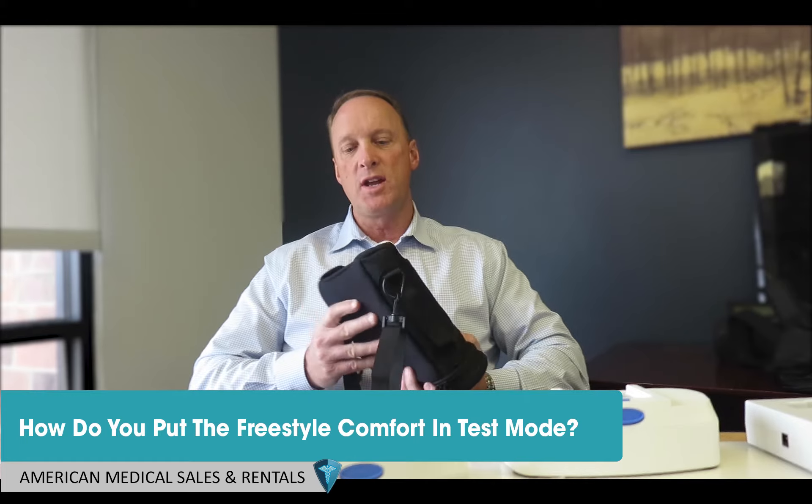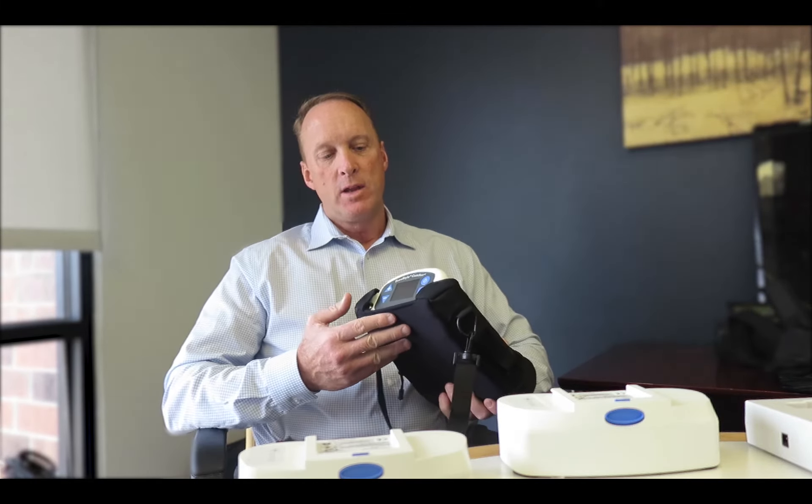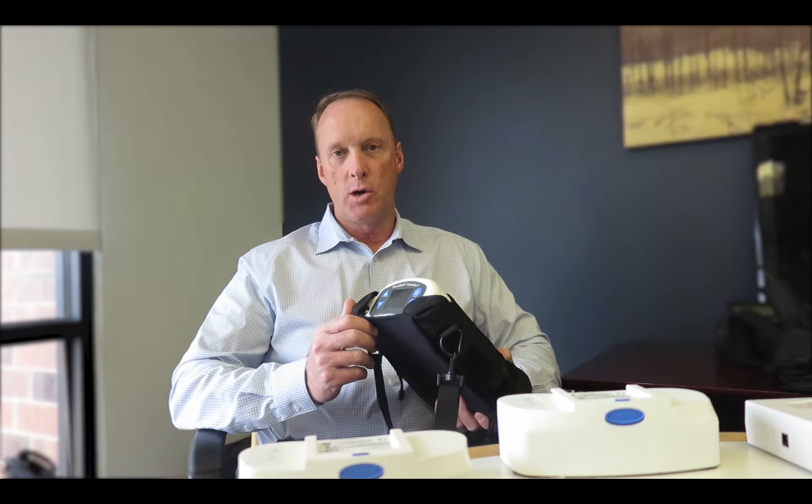There's a great feature called test mode that is part of the firmware. The test mode allows you to go into a mode to do one of three things. One is if the unit is alarming, to be able to see what those alarms are and the history of alarms.